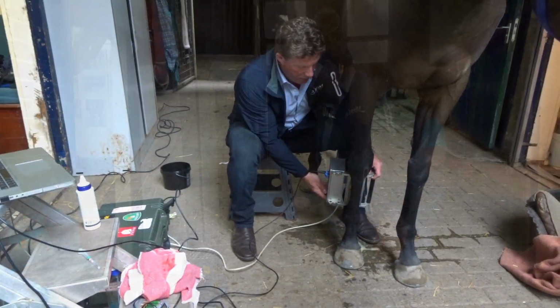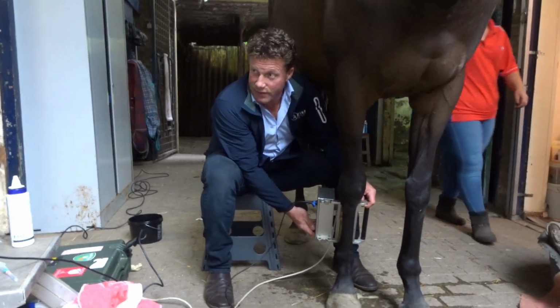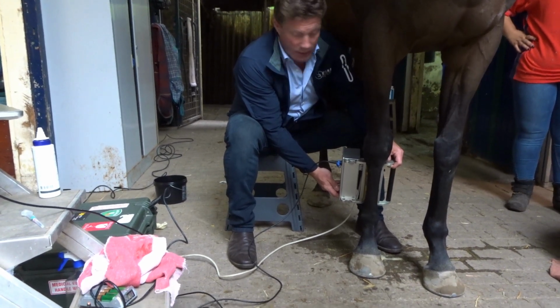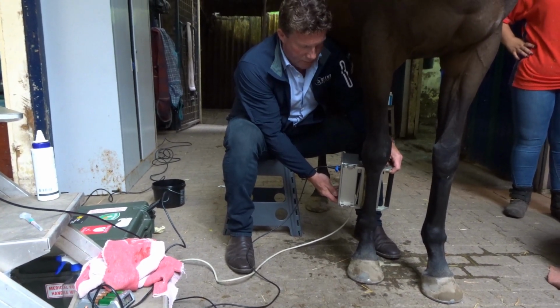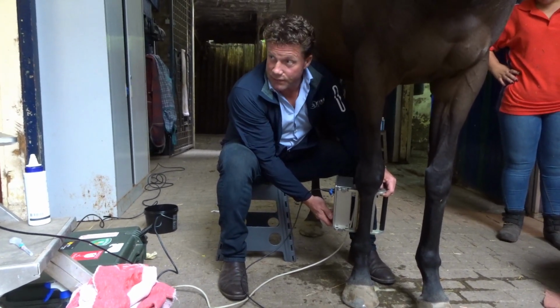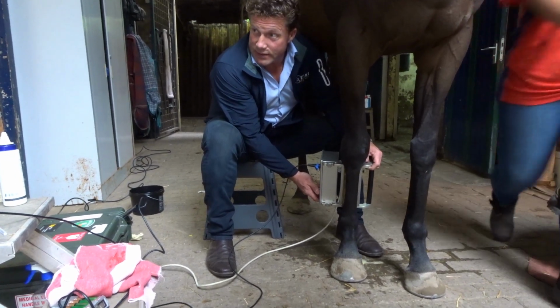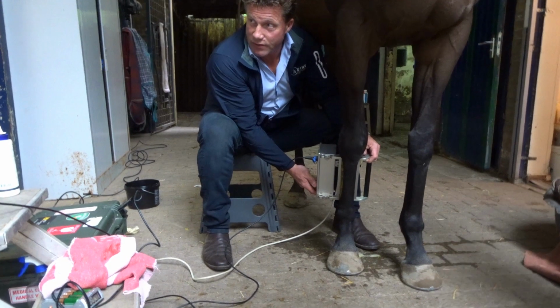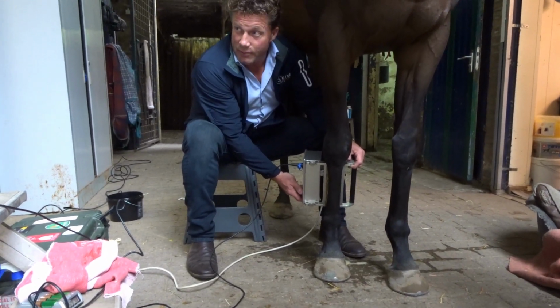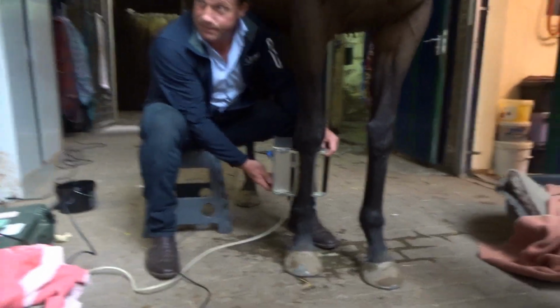Yeah. So what happens now is that the tracker is standardized in distance, so it can make 600 images of the tendon while it's tracking down. So it's priming itself now. So we start scanning now, and you will see it will move very slowly down. And while it's running down, it makes, as I said, 600 images of the tendon, and the computer then will put them together to make a full image of the tendon.